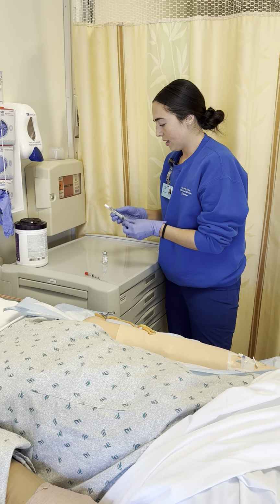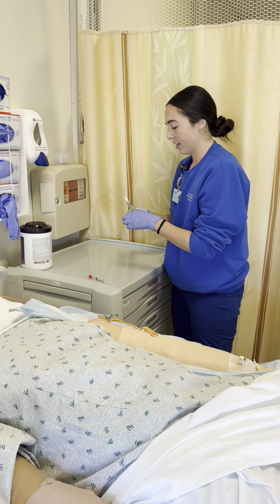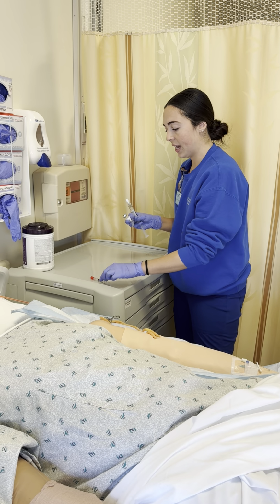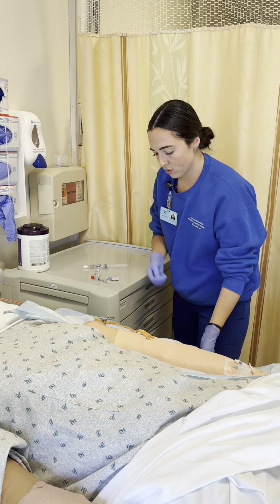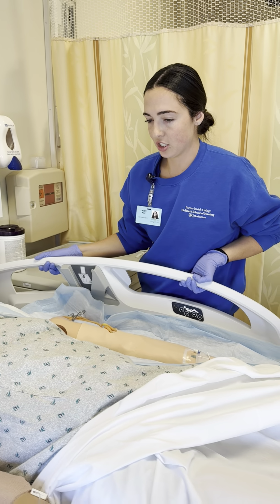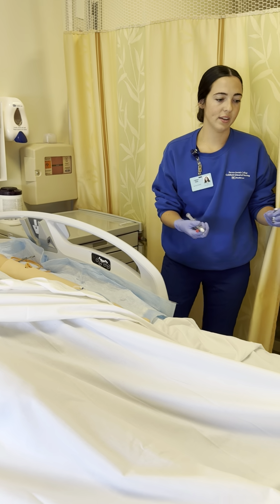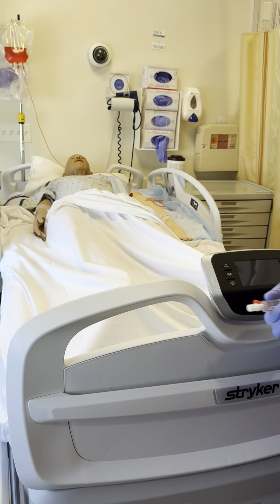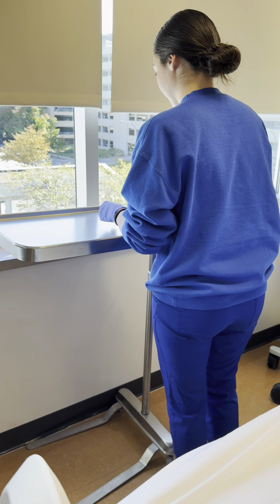Alright, so my next steps are to grab my sterile flush, my vial, an alcohol pad, and then my furosemide. I'm first going to lift this back up while I go to the other side and make sure that it's locked. Okay. So now I'm going to my other tray here. Make sure I've got everything.